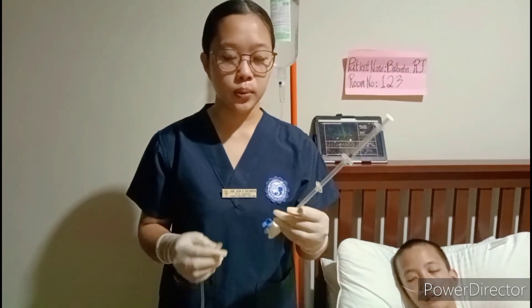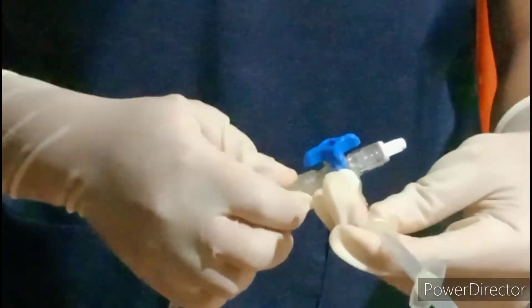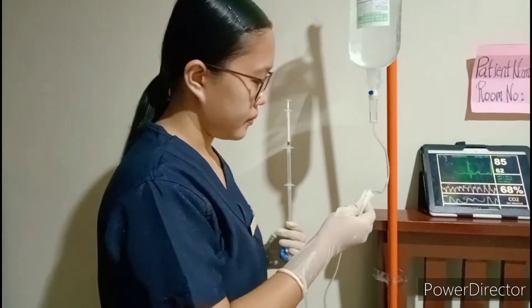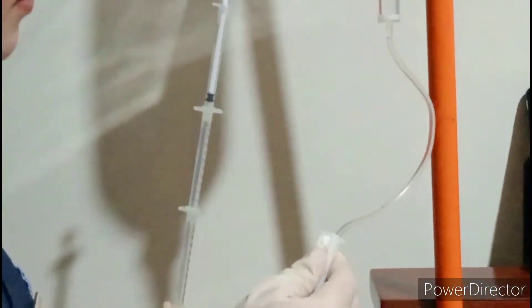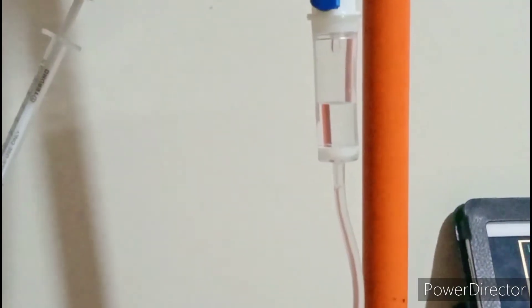Next, connect the IV tubing to the manometer. Prime the tubing and ensure all air bubbles are removed from the tubing. Then set up the manometer and attach it to the IV port.